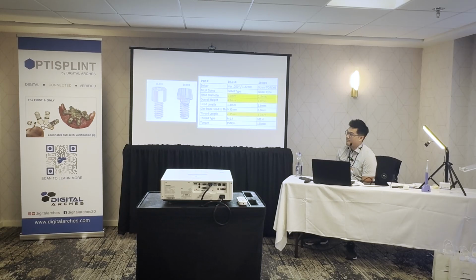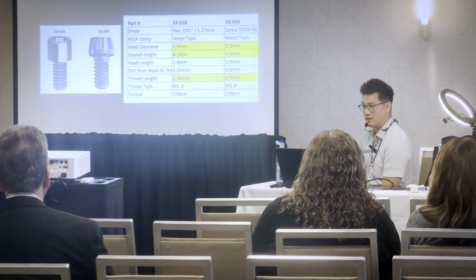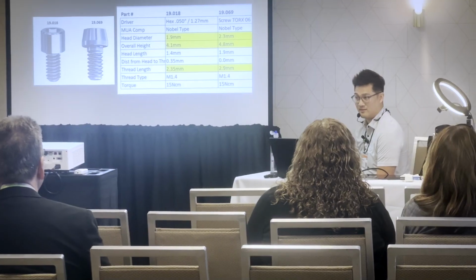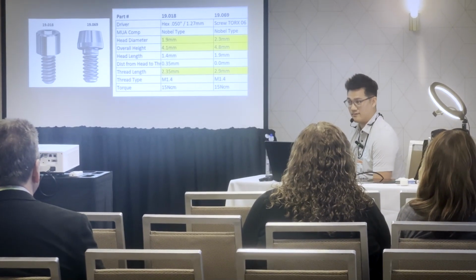And so now you're in a situation where, as of today, 2024, all of the major implant companies are working on their own screws. Within 6 months to a year, Straumann, Nobel, BioHorizons, they will have their own screws that go direct to the multi-unit. So what's going to happen to all these screws? There's no demand for them. They don't make anything else. They're all going to go away. And if you've done these cases, in 10 years you might be in a situation where you can't get these screws and you can't get these drivers.